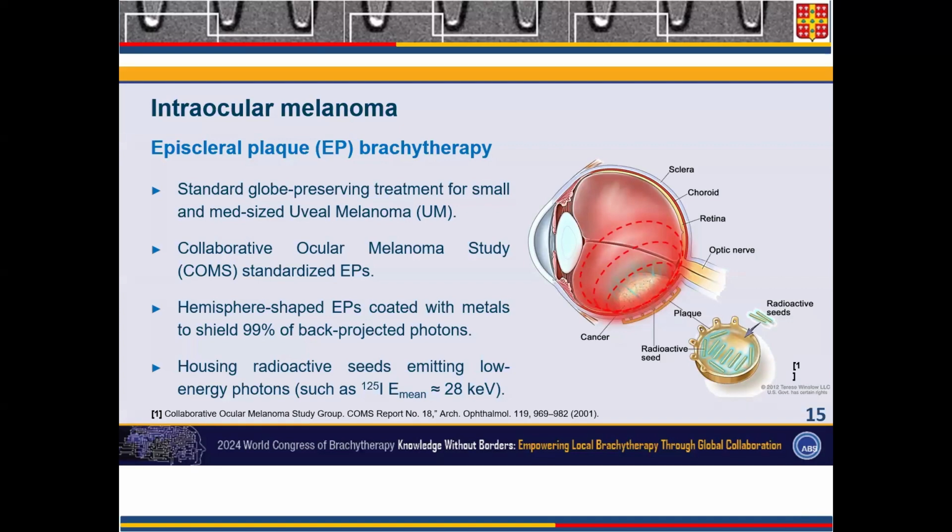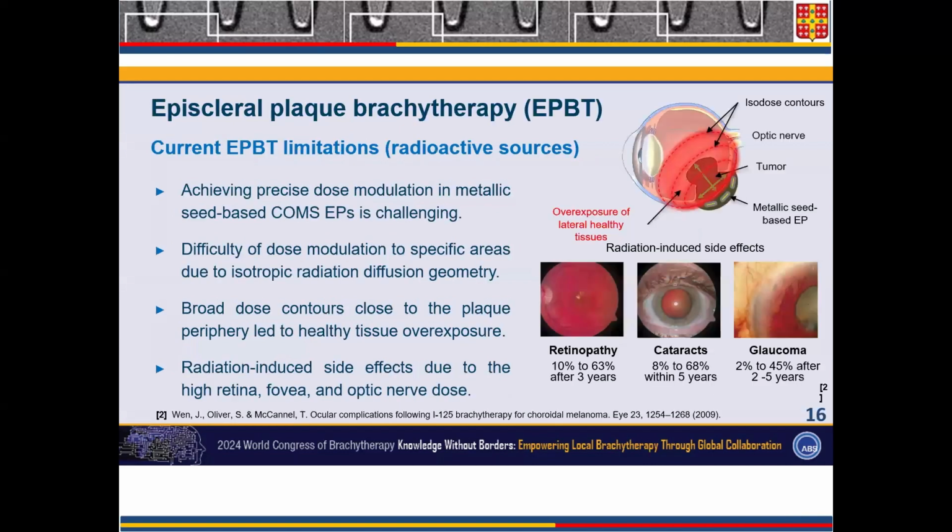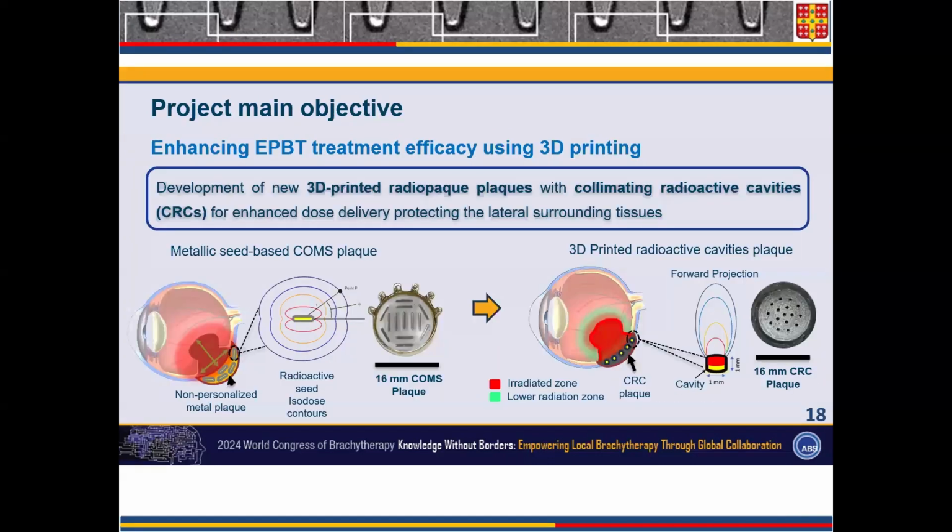And this is a presentation from my student Soheb Zekraoui, in collaboration with Marduk Akbari here. They went to the World Congress of Brachytherapy this summer in Washington, D.C., and presented the latest results of the 3D printed plaque. One important component of the 3D printed plaque for eye cancer therapy is the new filament that we've been using.